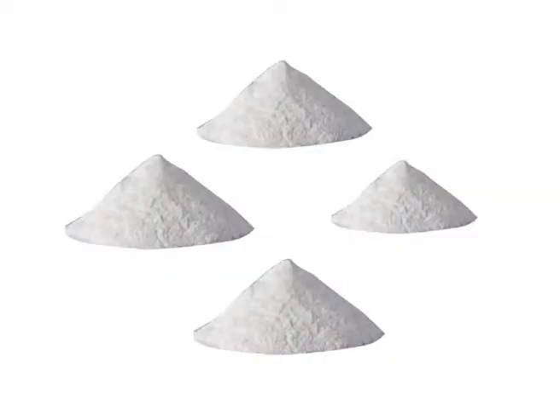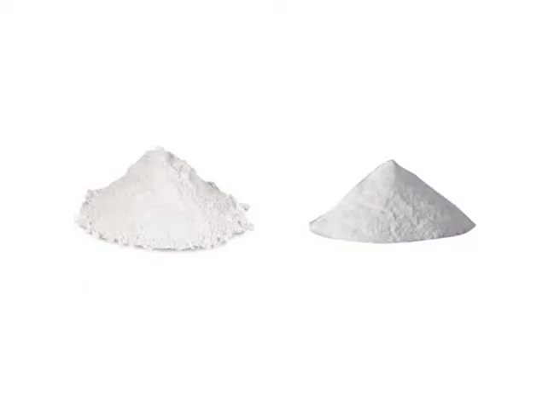If the material in all the packages is found to be similar by visual examination, one of the two following approaches may be followed. The contents of the packages may be combined and the combined bulk material may then be homogenized. Alternatively, chemical testing may be applied to each of the packages. When different types of materials have been identified in various packages, each subgroup should be composited in an identical fashion.